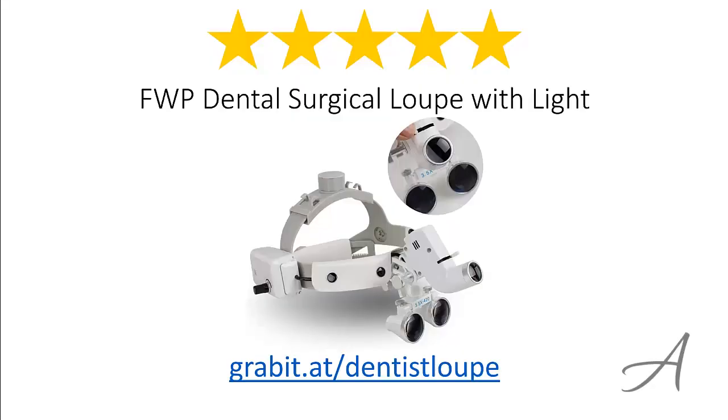So there you have it, the FWP Dental Surgical Loupe with Light. Considering its ease of use, the quality of the set, and its overall functionality, we feel that this dental loupe is the most valuable for the money.